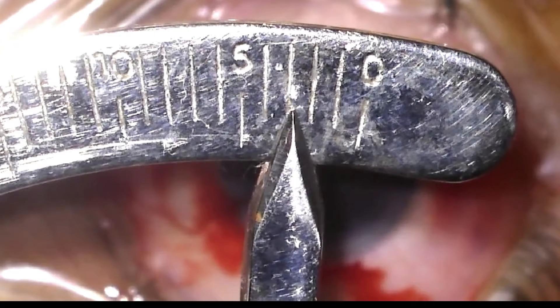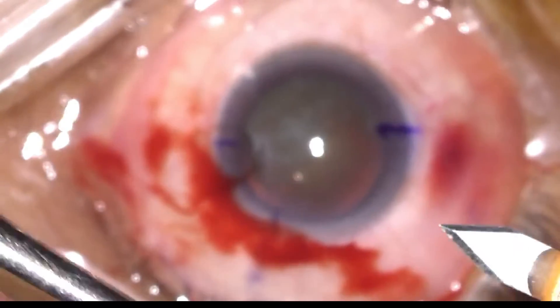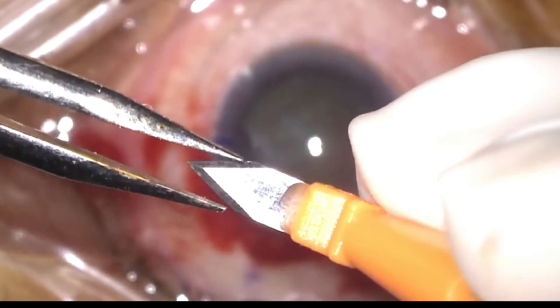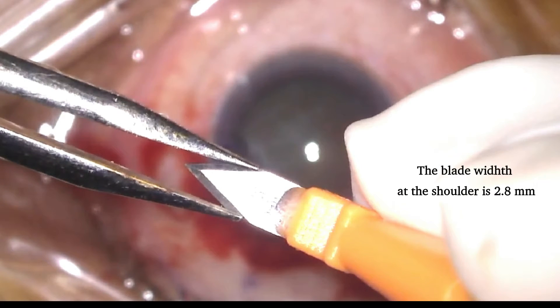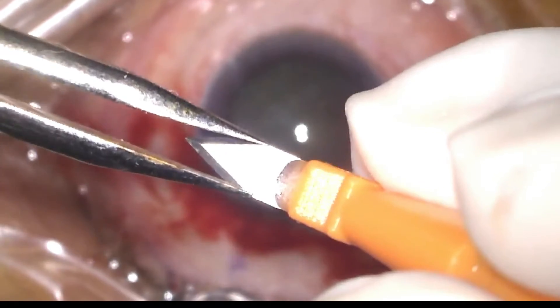Let's look at the blades more closely. You can see we've taken a measurement of 2.8mm on the caliper and let's compare this with the actual width at the shoulder. As mentioned earlier, the width of the blade at the shoulder is a perfect 2.8mm. So when we create our 2.8 tunnel, when the widest part of the blade enters into the cornea, we are creating an incision which is 2.8mm wide.